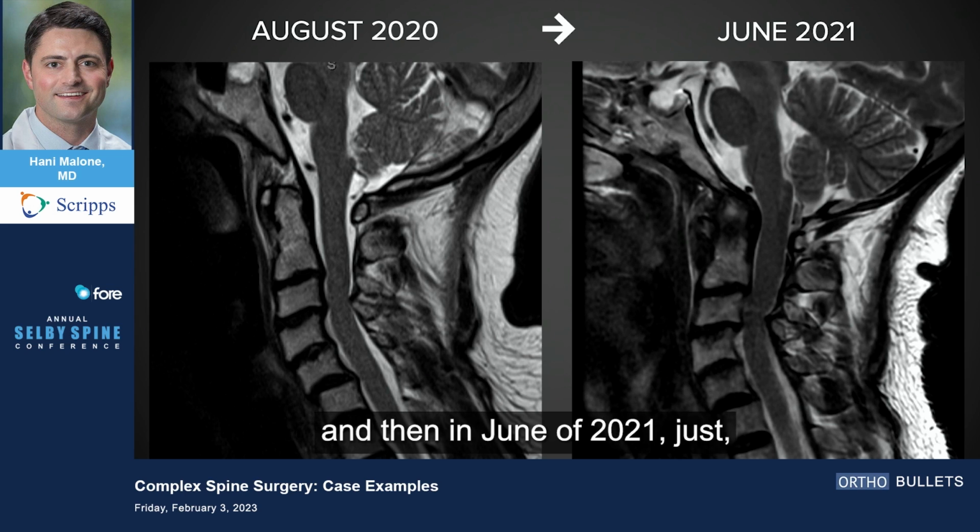And then in June of 2021, just 10 months later, you can see that there's been a significant progression, both in terms of the retrolisthesis at 3-4 and the cord compression there, but also with the basilar invagination.